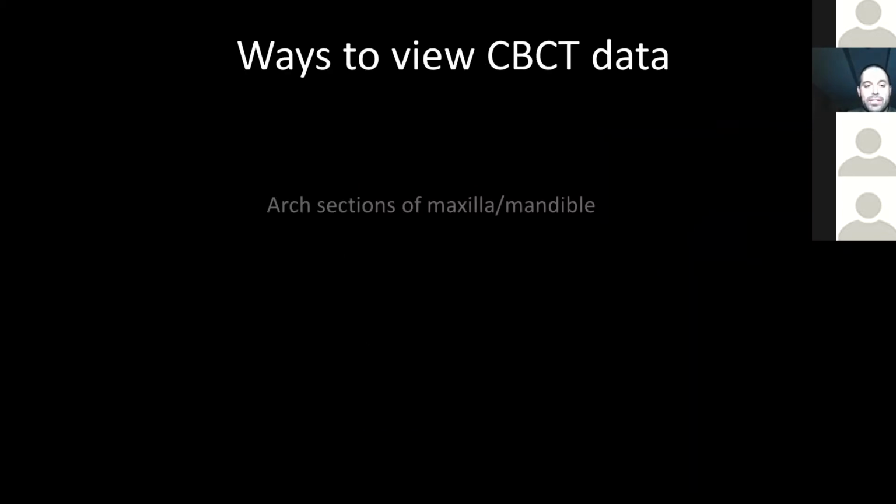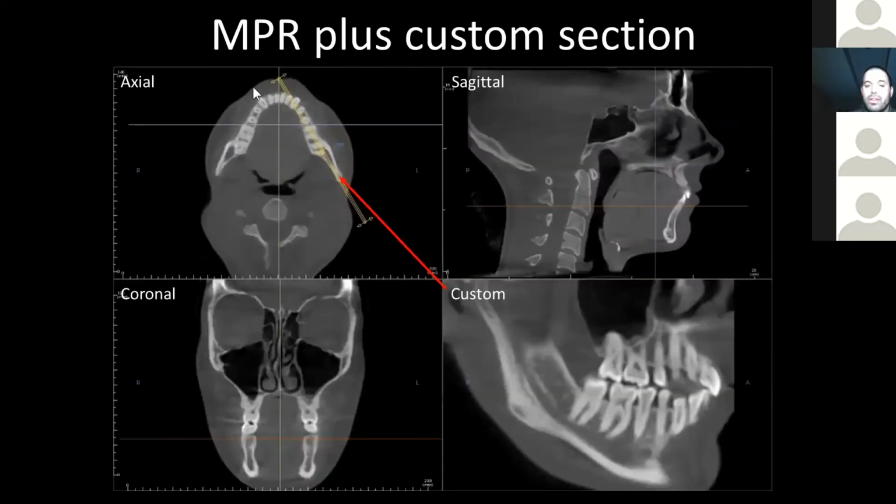Okay, so that's MPR views. Before I move on from this, again, I'll reemphasize that you can take that CD that comes into your office or open up your brand new cone beam CT machine and find this view. It's many times going to be default. They're one click away, and start to scroll through your patient top to bottom. And that's the best way you can review everything front to back, top to bottom, side to side. And we can discuss a little bit more about that review next week.